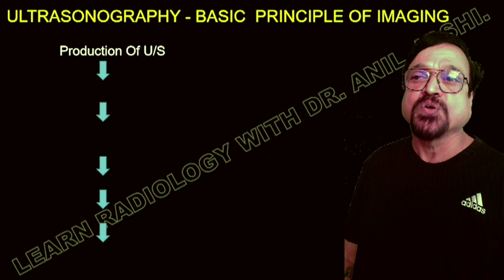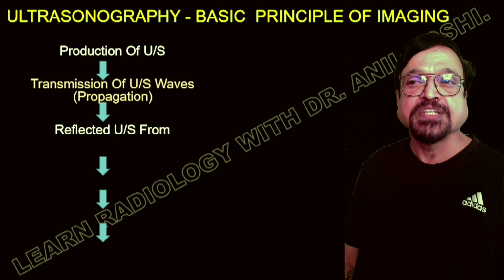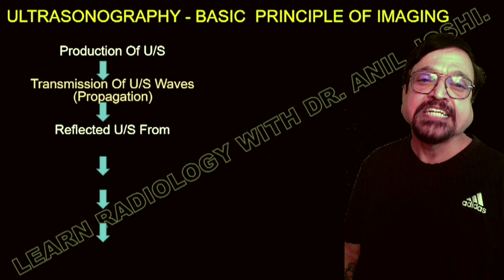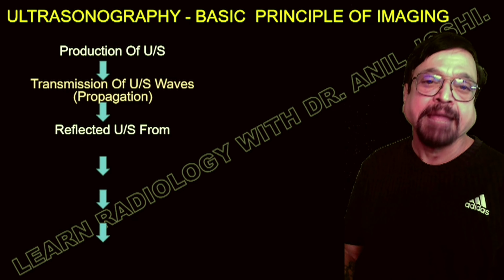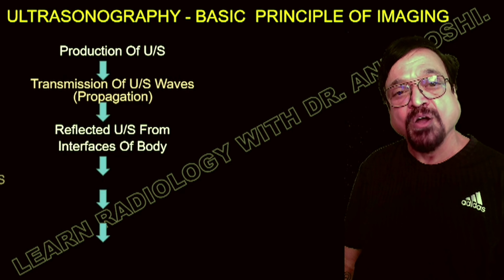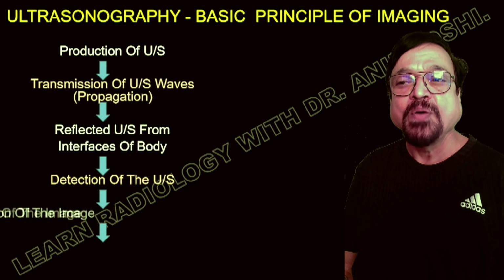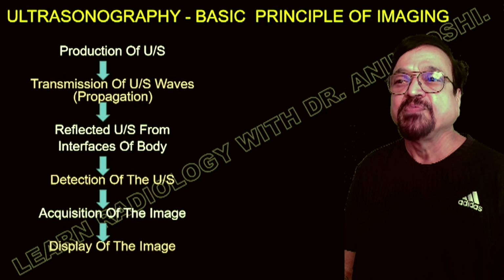Here we are shown in a diagram how the production of an ultrasound wave is done by transmission of electric energy into mechanical and then into ultrasound, then back again, and that causes a crystal to vibrate, and that again gives a signal, that is, conversion of ultrasound wave into electrical energy. So that is how the phenomenon takes place, and we get the images.